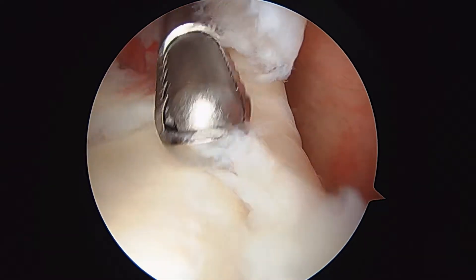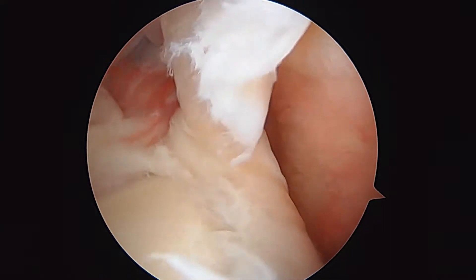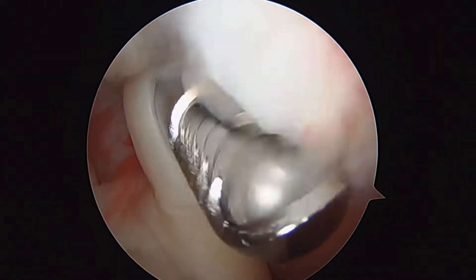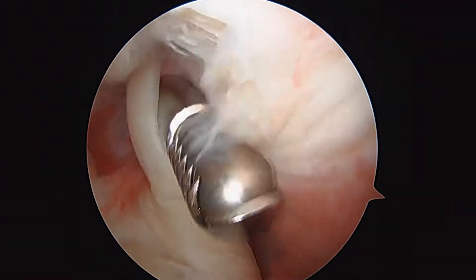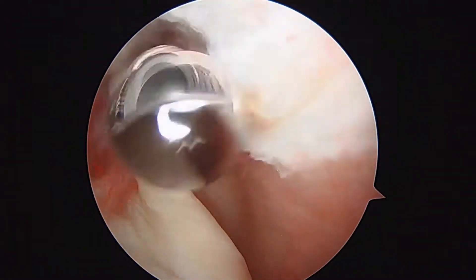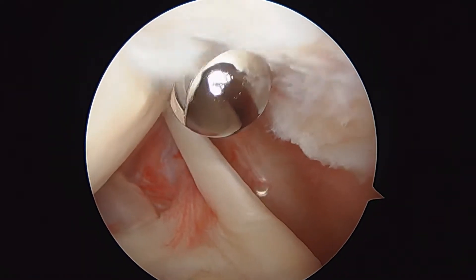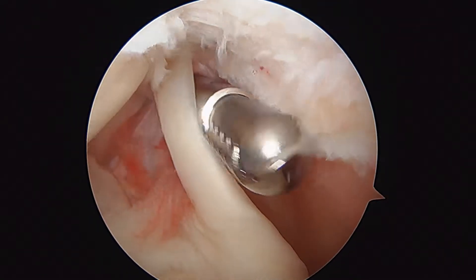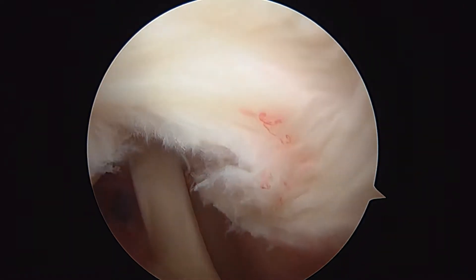It's a little bit loose — right on the edge. You can see here some chondral degeneration. Here's the rotator cuff tear right here. We're going to debride this a little bit more, too. The tear also involves this insertion right here.